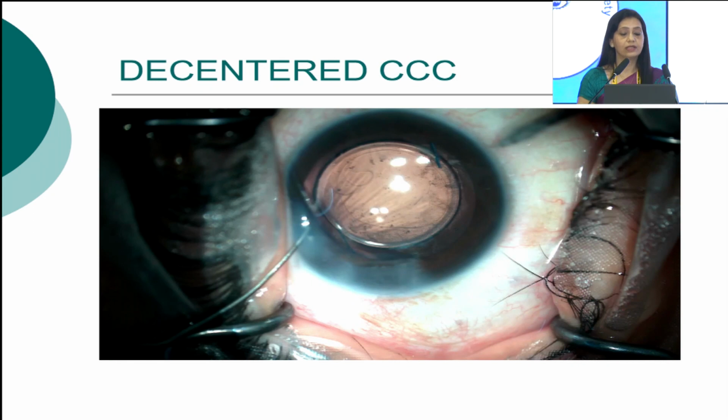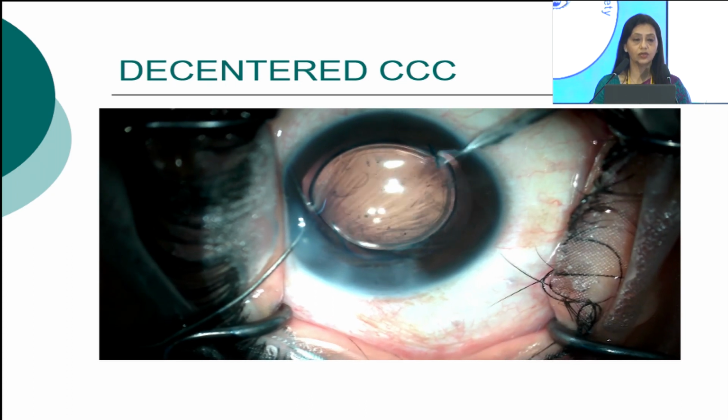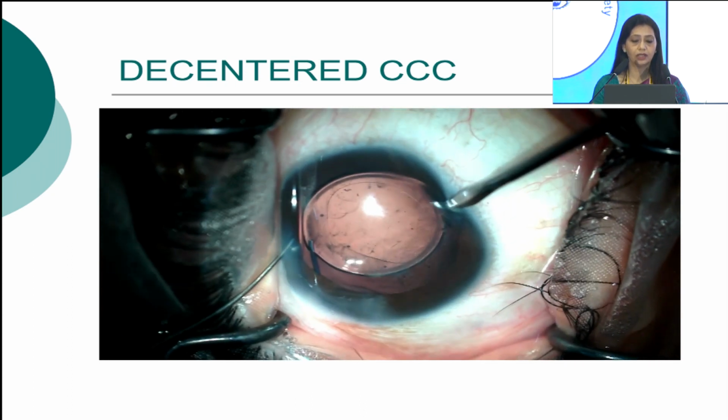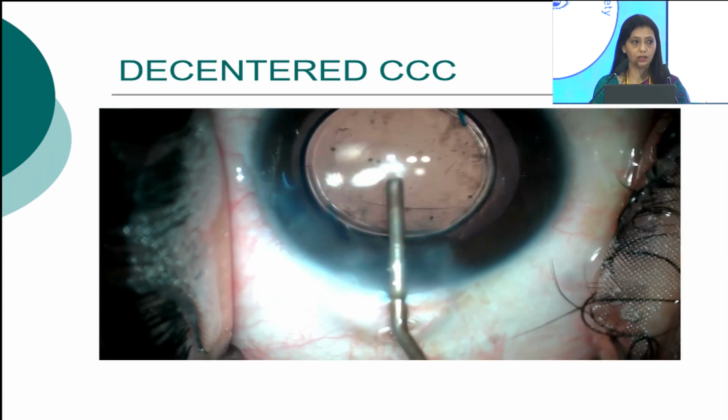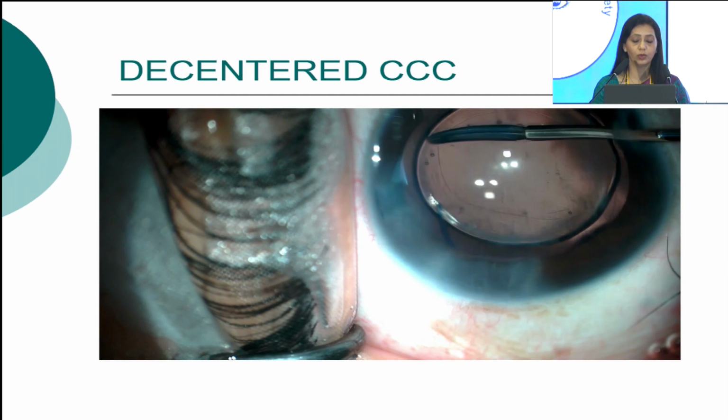Dealing with a few cases in which we have a decentered capsular rhexis. If you see in this case, the rhexis is not a central one. So after implanting the IOL, we should not just leave it like that. What we can do is, as shown in the last video by Dr. Purval sir, he also mentioned it.